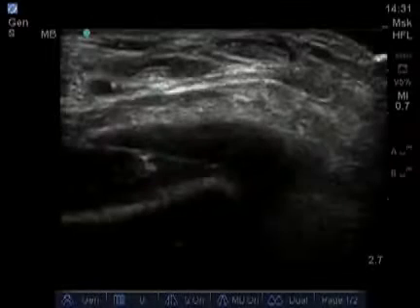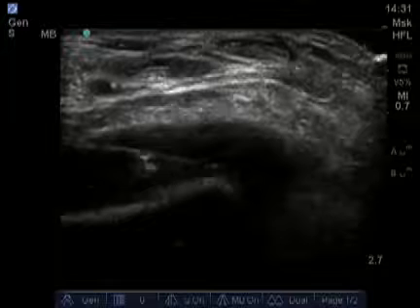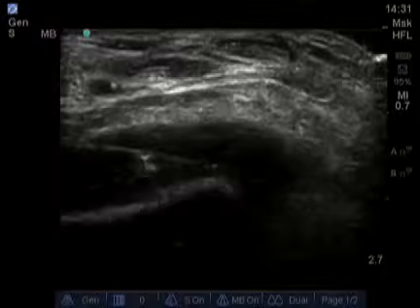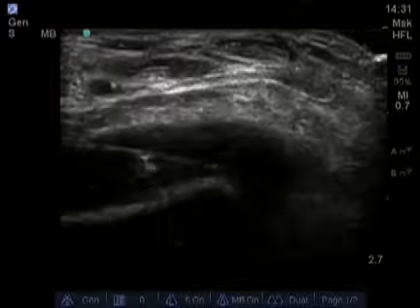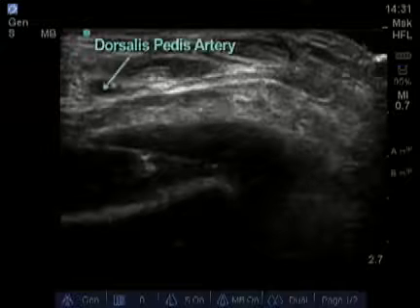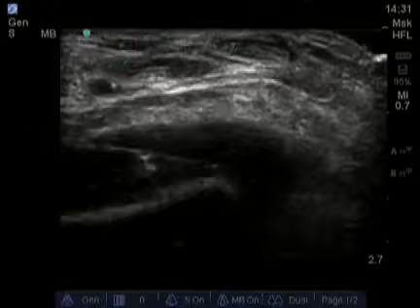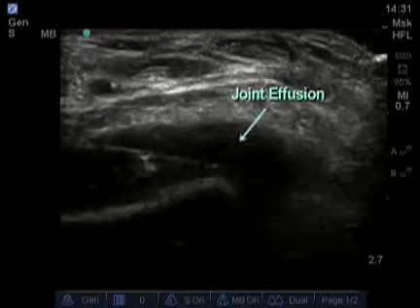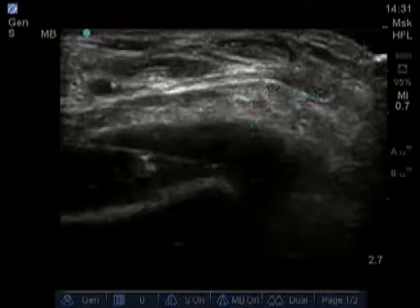Here is an image taken of a person with an ankle effusion. This is a transverse image, so we don't really see the tibiotalar joint with that classic V presentation. We see the bone here, and we see an artery — probably the dorsalis pedis artery here. This hypoechoic and anechoic black area is all joint effusion with synovial proliferation.